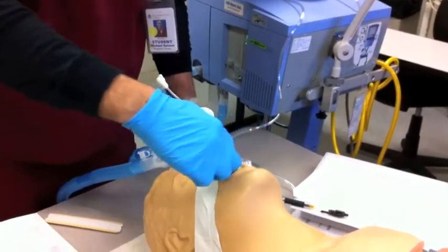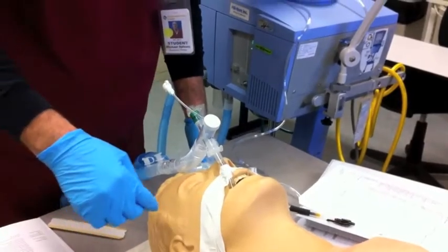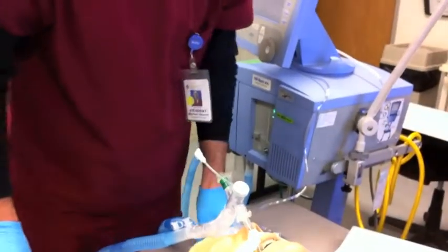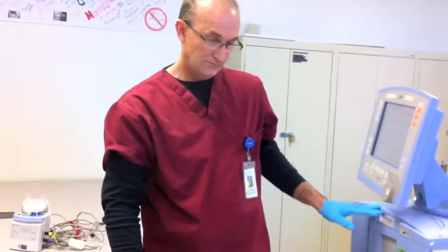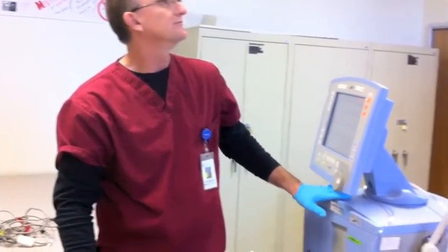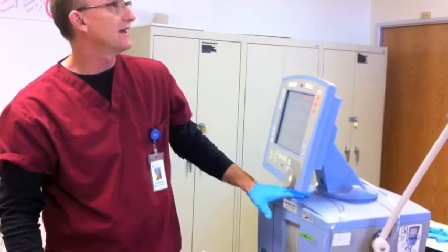He's going to put some lip balm on his lips and then brush his teeth. Next, he's going to monitor oxygenation by checking his pulse oximetry. It's at 98%.